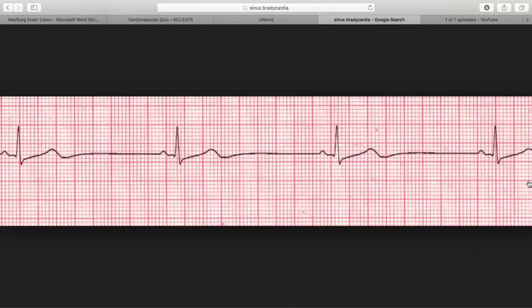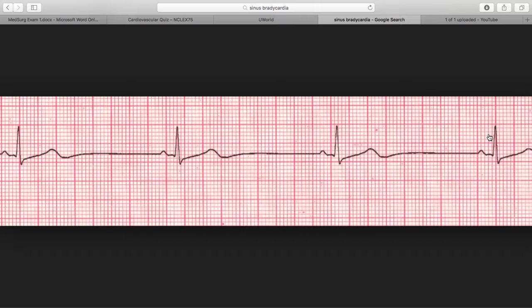Is it regular? Yes, it is regular. Now measuring regularity — we have to take our little paper strip and mark every single QRS tip, the tip of every QRS, and measure it to the next one and the next to see if it's the same width apart. So yes, it is regular.